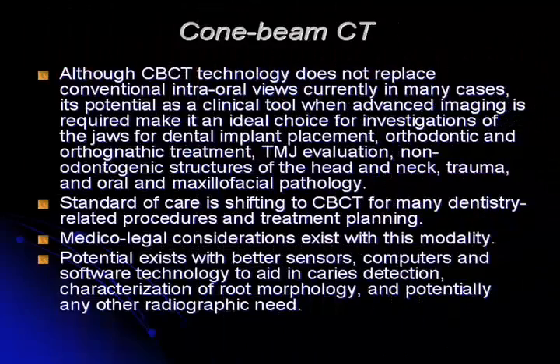Right now we don't do it because it's not as sensitive and specific for caries detection or periodontal disease detection, but that's changing right now because oral radiologists are on the cutting edge of research in fine-tuning this technology and the software associated with it for allowing us to start looking at things like caries and periodontal disease and pocketing, three-dimensionally and two-dimensionally with these different slices. So it will become the standard of care in the very near future for probably any dental imaging procedure that needs to be done. And then the medical legal considerations are important.